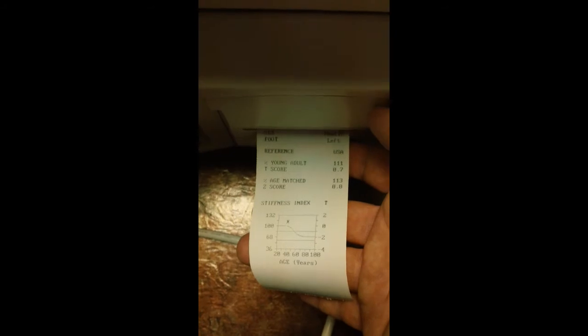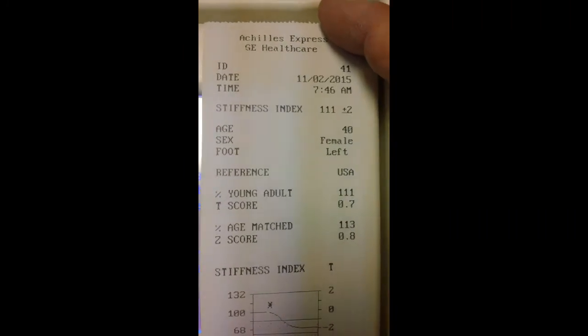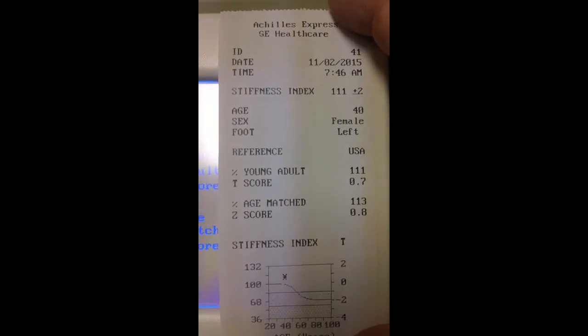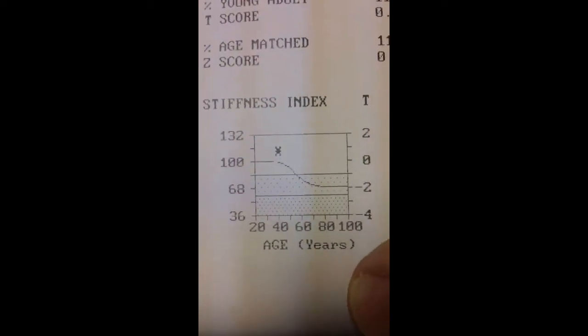You can take these results and actually print them. The screen on the system toggles, so if you wanted to flip this back towards the other individual or towards yourself, you have the ability to toggle the screen. The results print right out of the back of the system. You can give them to the individual that was scanned so they can keep them for future reference, or you can put them in the patient file. You also have an option to do an 8.5 by 11 full-size sheet of paper. You can see here the date and time the scan was done, the stiffness index results, the individual's pertinent information, the T-score equivalent, the Z-score equivalent, and the stiffness index graph — all on one simple sheet.